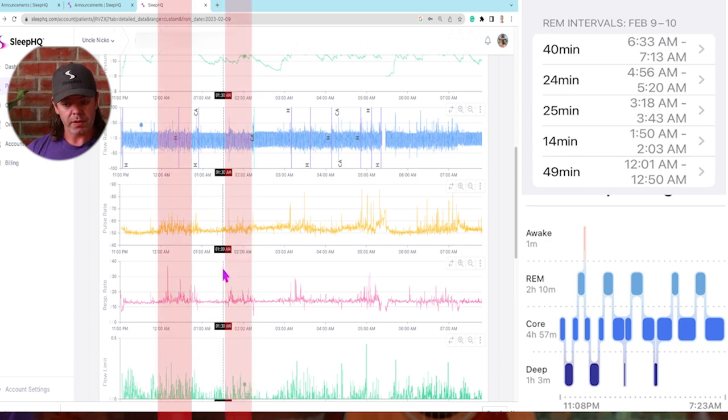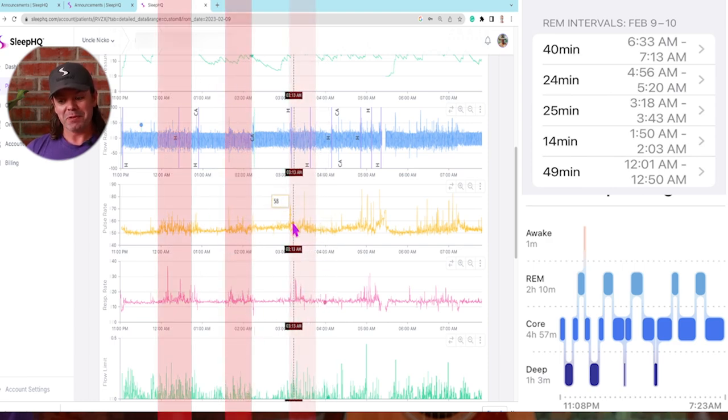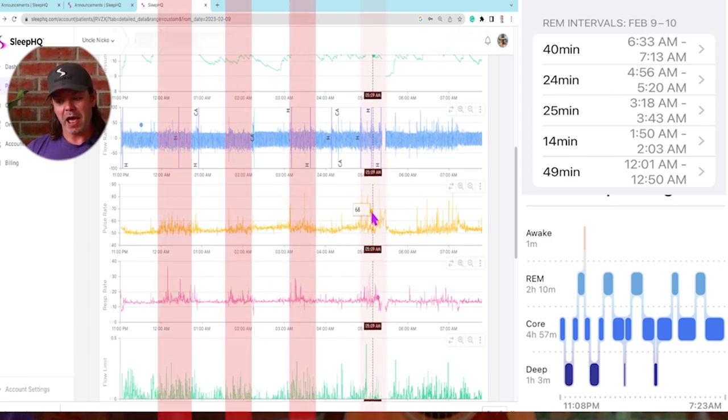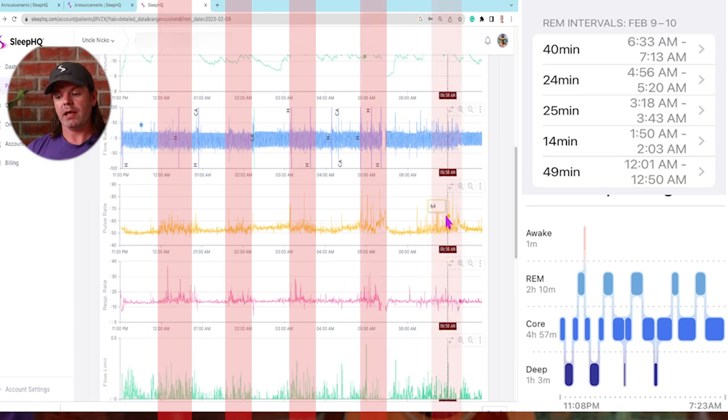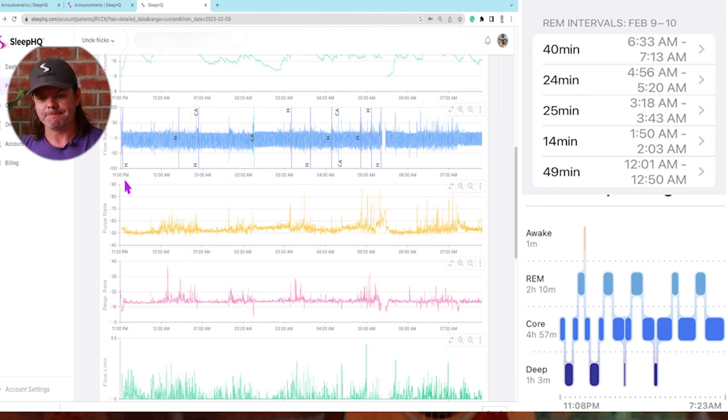I can see another period here. I can see another period here, another one here, and another one here. Let's see if they match up with those timestamps.